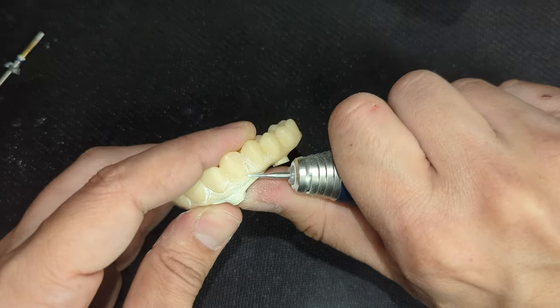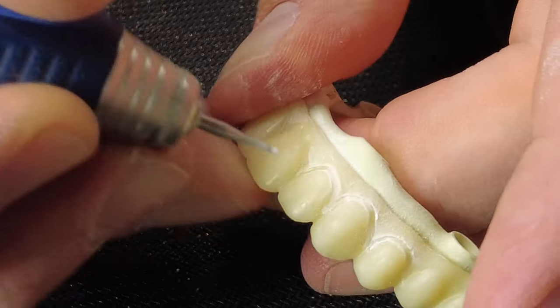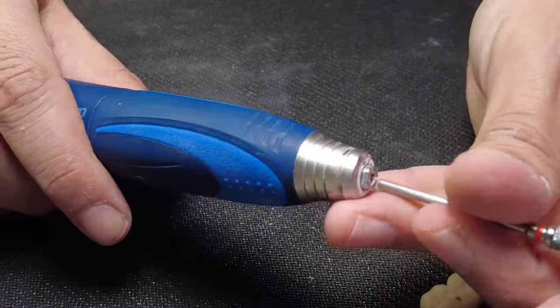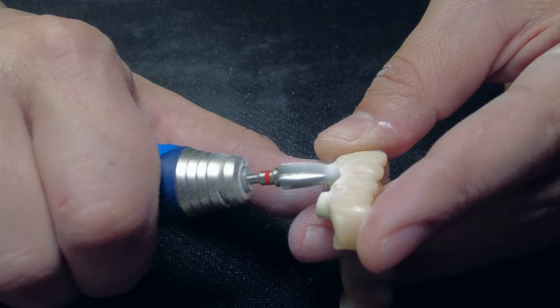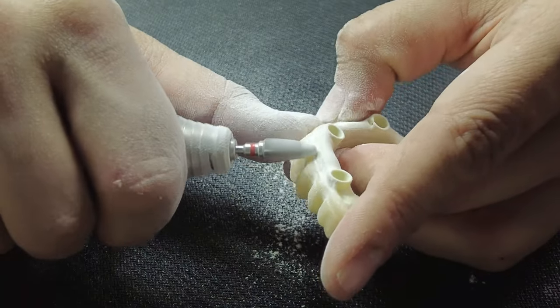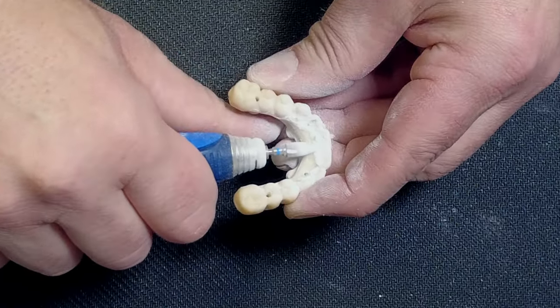Using a small carbide bur, I carefully trim around the neck of the teeth to separate them from the gingival area. This step makes it easier to refine the gingival section later without damaging any tooth structure. Next, I switch to a larger carbide bur to thin out the margin between the bar and the jacket. This area will be covered with gingival material, so creating some space — even if it means cutting through the nano ceramic into the Trilor — is acceptable.